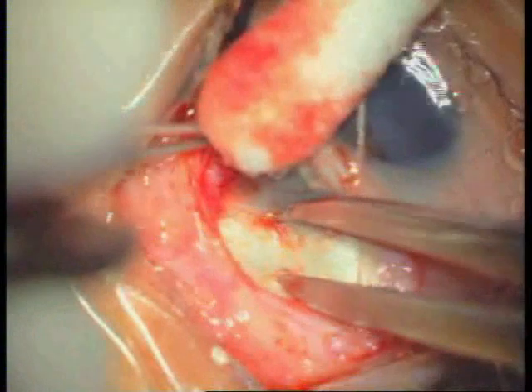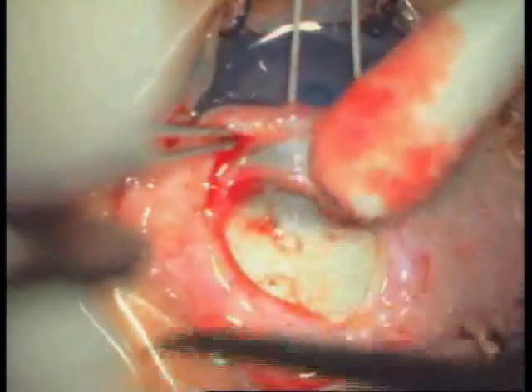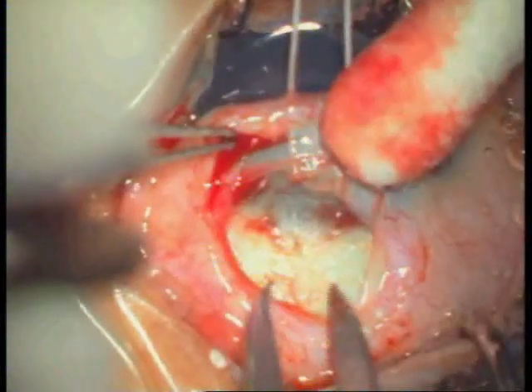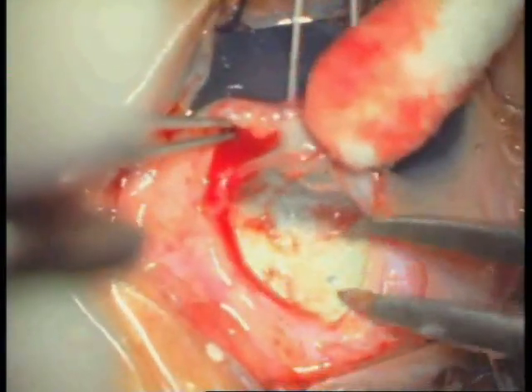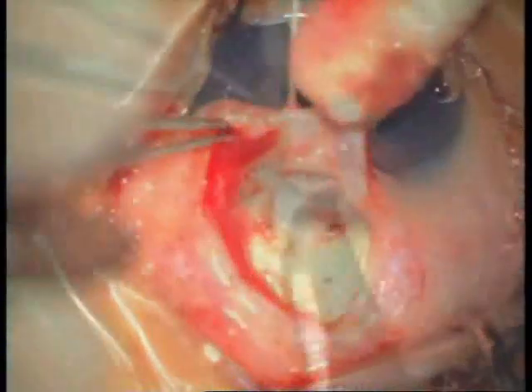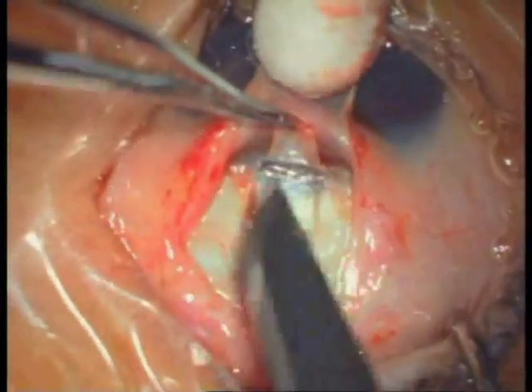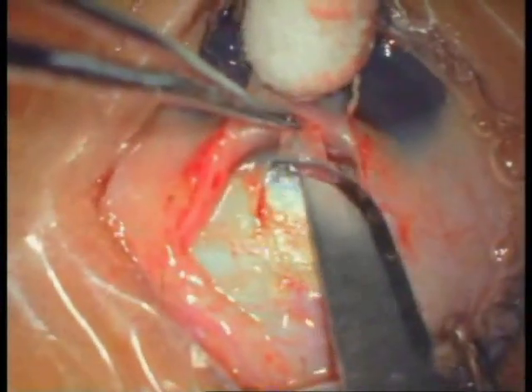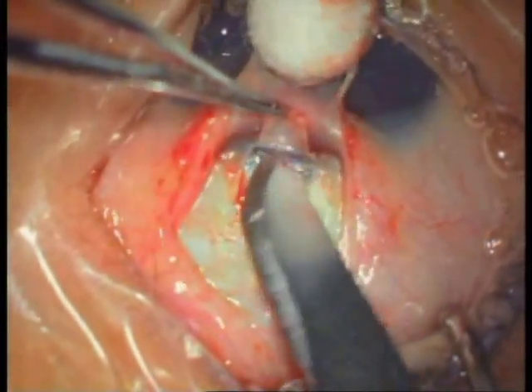A partial thickness rectangular flap of 4 mm by 4 mm is made using a Castroviejo caliper. Careful dissection of the sclera is done until the clear cornea is reached. The limbal anatomy is carefully studied under high magnification.